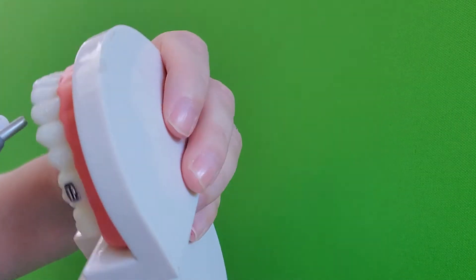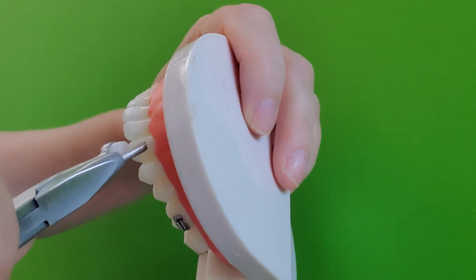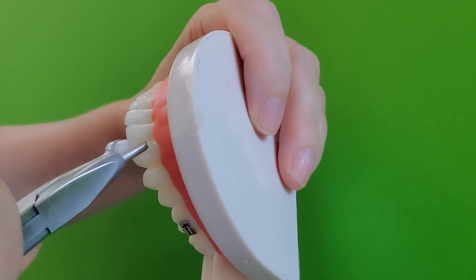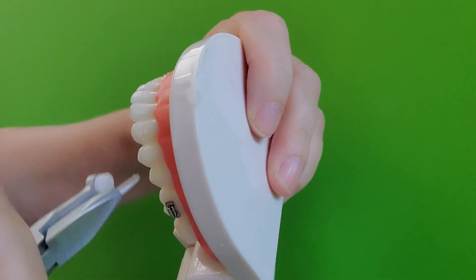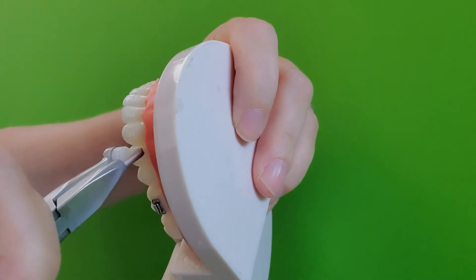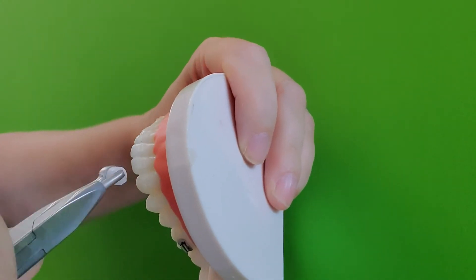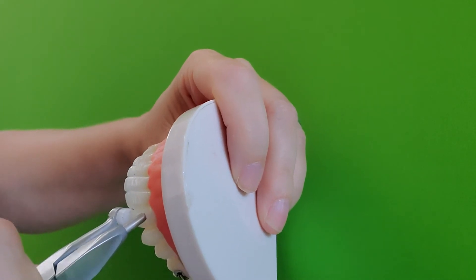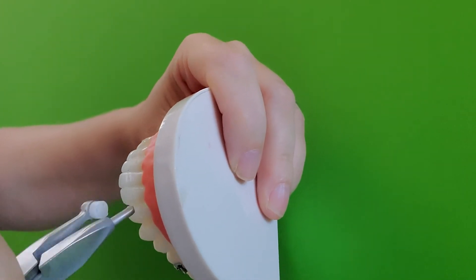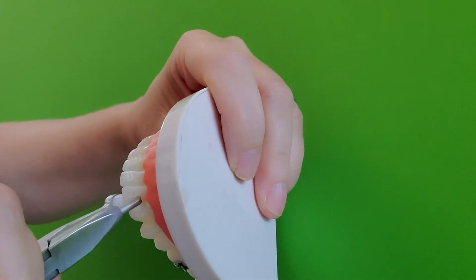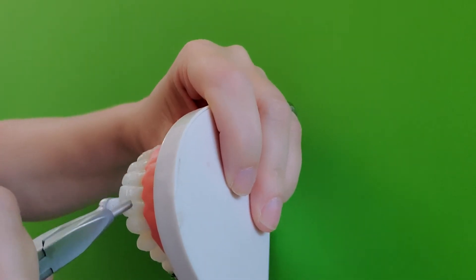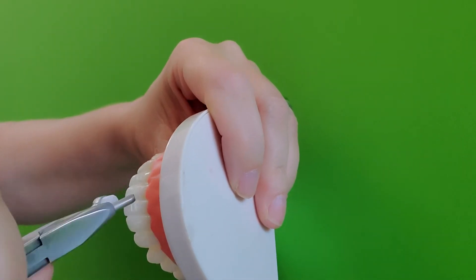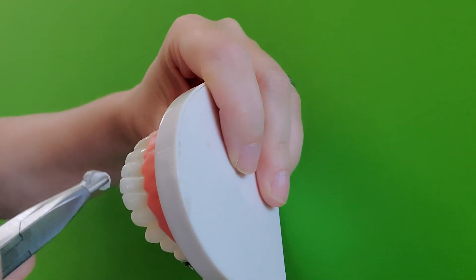This is a great way that staff can take the glue off for you. In most states, staff can take off supragingival cement. You have to read your duties and how it works. It can't take off subgingival.